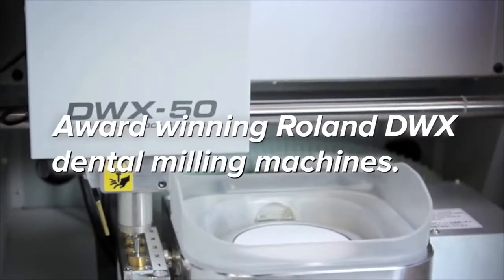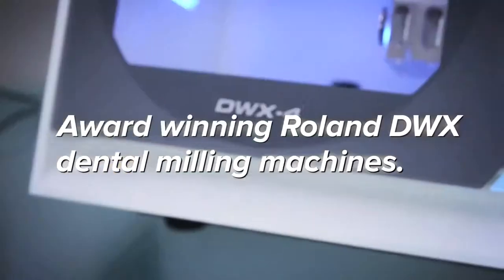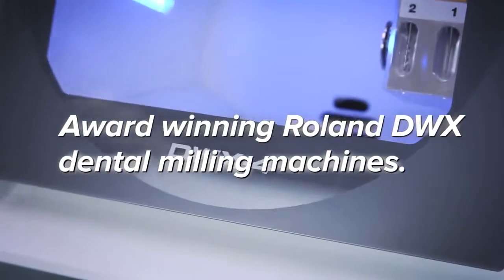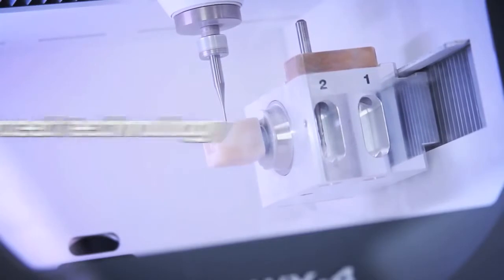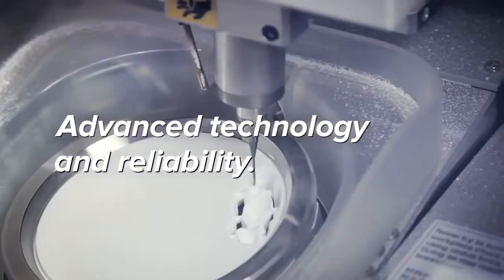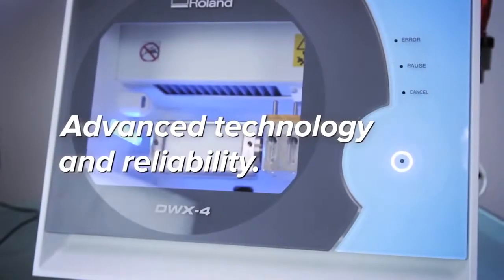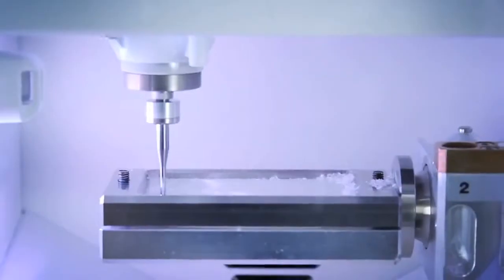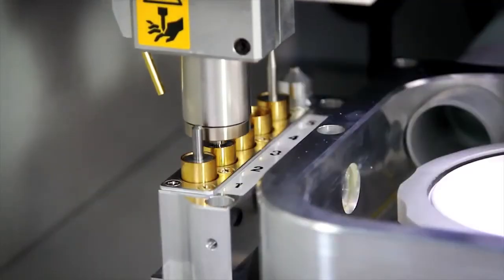The award-winning Roland DWX Series Dental Milling Machines are known for their advanced technology and reliability, producing dental restorations with uncompromising quality in an affordable, scalable solution.